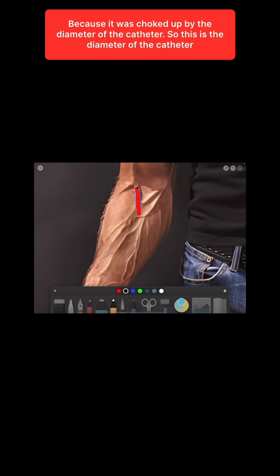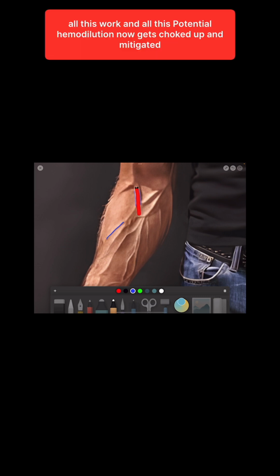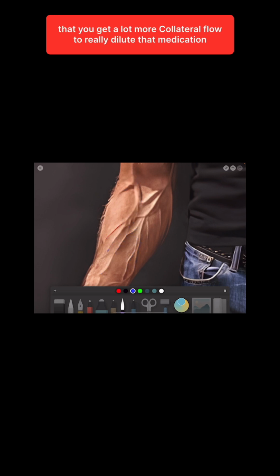So this is the diameter of the catheter, and this is the diameter of the vein. So not that much different. And so your catheter to vein ratio is a lot higher. And so that mitigates all this work, and all this potential hemodilution now gets choked up and mitigated. And there is a traffic jam here, which doesn't allow for hemodilution except from this collateral flow. So this collateral vein is what's helping to dilute it, but you're missing out on all these other potential hemodilution pathways further behind or further distal, so that you get a lot more collateral flow to really dilute that medication.